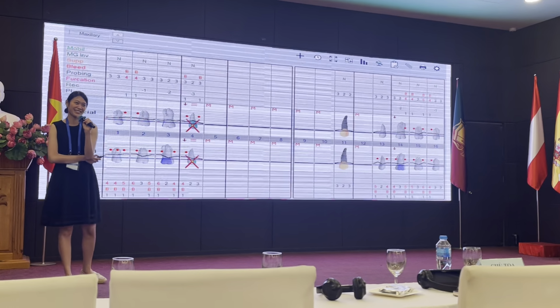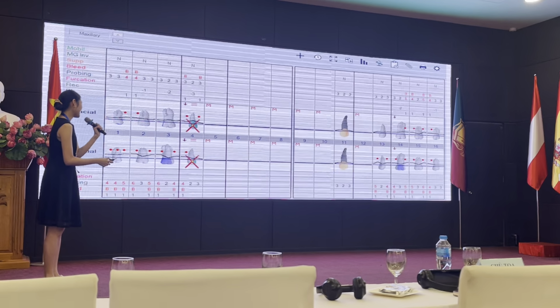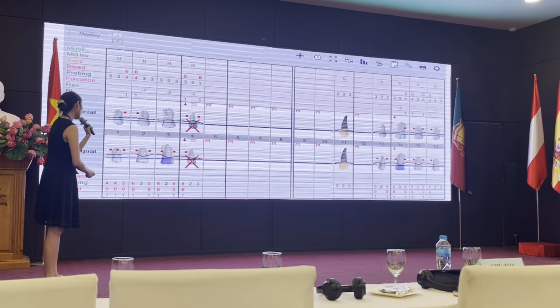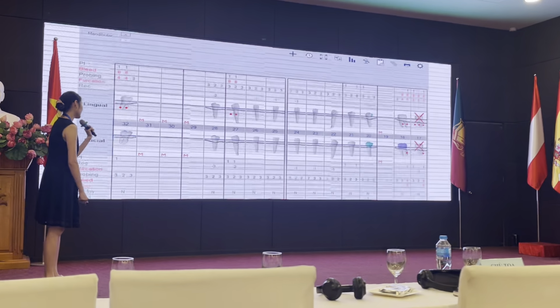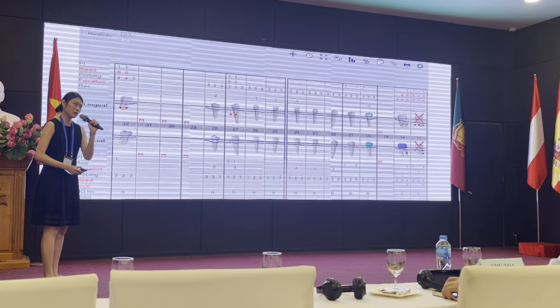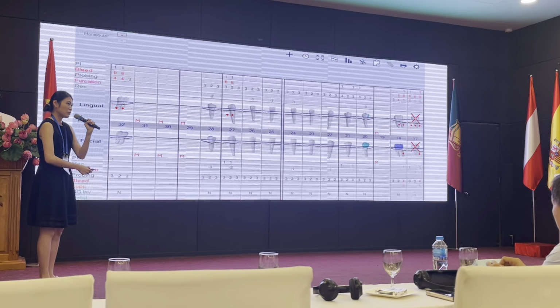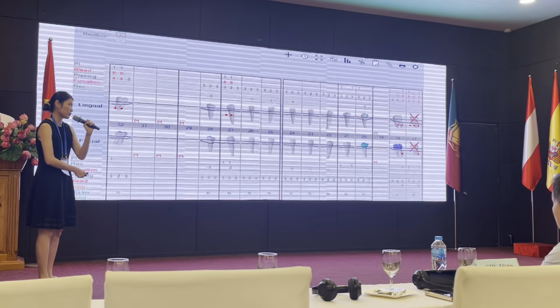So the first thing I did was I referred the case to my periodontist. And as you can appreciate here, we have some deep probing and some bleeding on probing, and some teeth are considered irrestorable. And although the mandible doesn't look that bad, imagine if you want to restore the occlusion to an ideal occlusal plane, it might be really challenging. So treatment planning is actually a decision between prosthetic and periodontal.